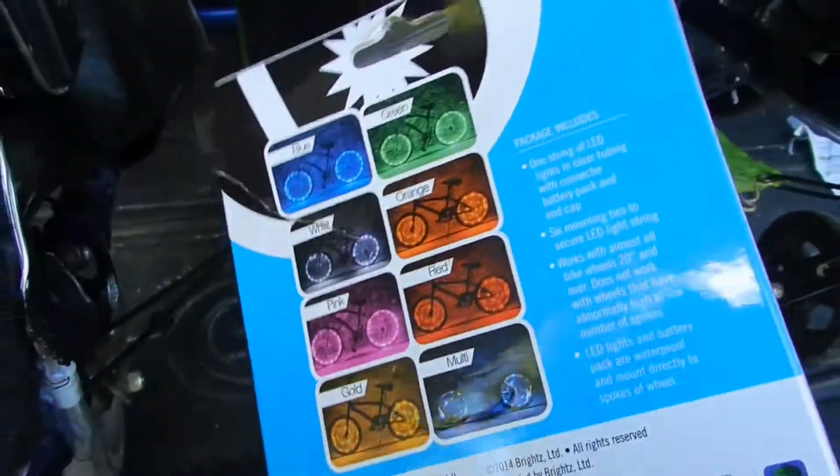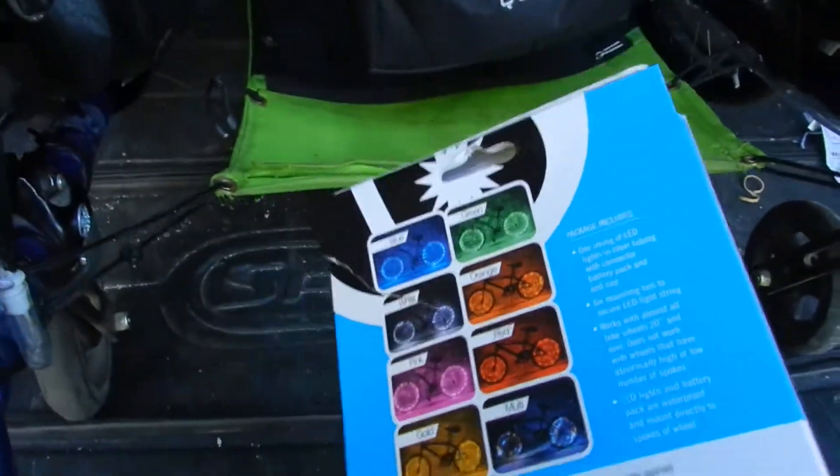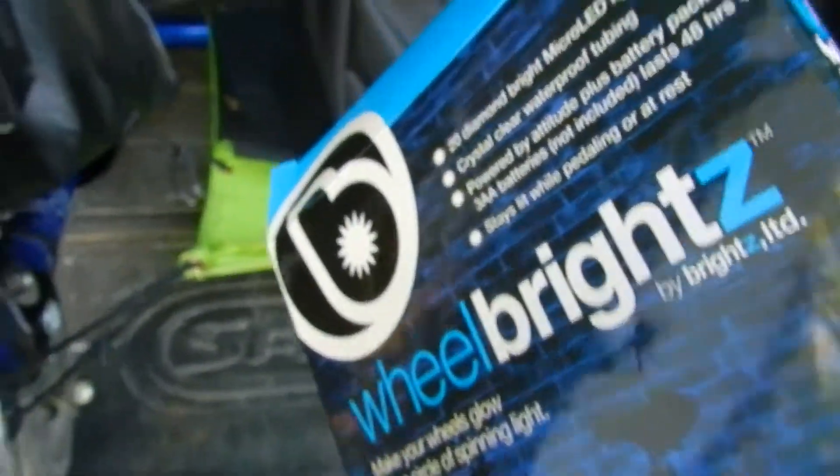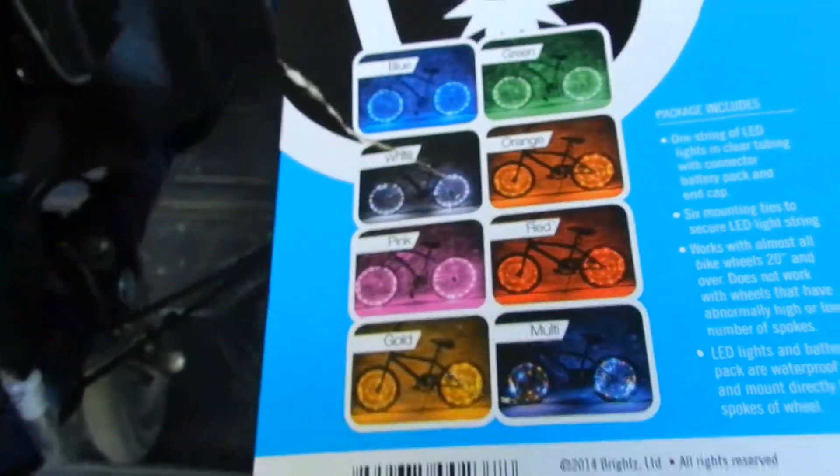So about $10, maybe $11 at Walmart — you can probably find them at a different place. It's Wheelbrights. I've got the color blue and it comes in all different colors, so whatever you like.